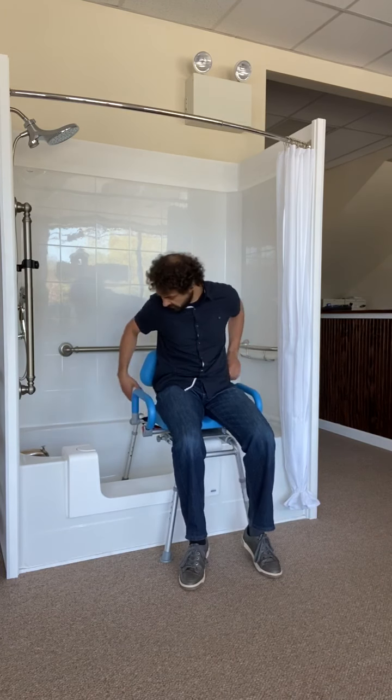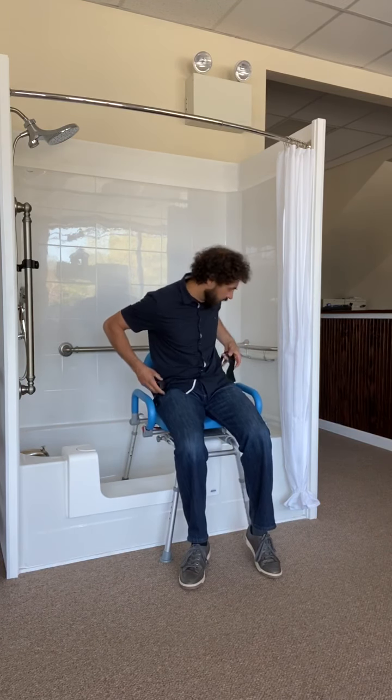Once we're here and we've swiveled over, we're going to push down on the right side lever again, and that's going to allow us to swivel. Throughout that whole time, there's also a seat belt that can absolutely be utilized, which a lot of folks find valuable if there's a challenge with sitting balance.